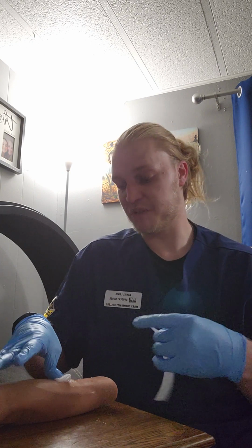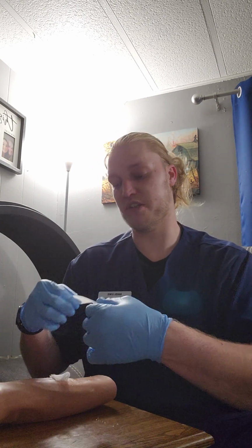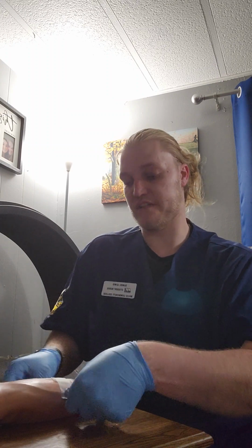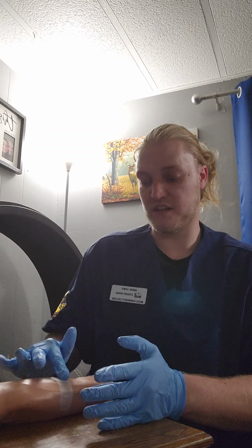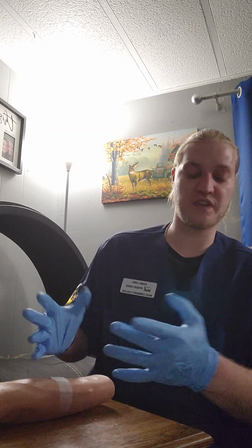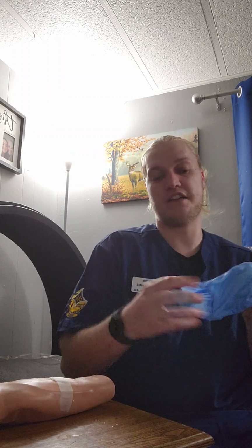While I do that, I'm going to look for any signs of redness or anything around that, and I would apply some tape just to cover that up until it quits bleeding. Again, that's the sterile dressing and the tape. And then I'm going to discard all of my equipment, my gloves, everything else, and I would document all the relevant information in the nursing note and the MAR.